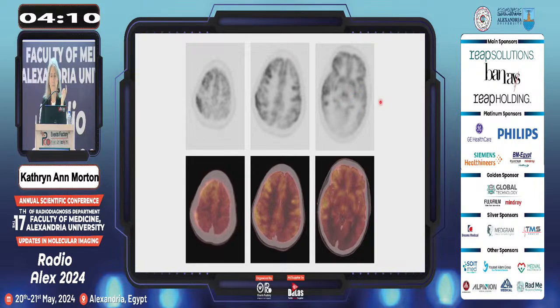This is an anti-NMDAR encephalitis with multiple areas of increased activity within the brain, as well as a decrease in uptake within the posterior brain. When you see this pattern, it's fairly typical for anti-NMDAR encephalitis. So it's autoimmune mediated, but this large area of decreased activity, I mean, the other possibility, could this be a Lewy body dementia? You would not expect to see these sort of other areas of increased activity. Surprisingly, in this patient, the MRI was practically normal.